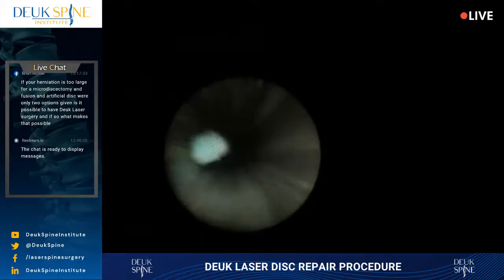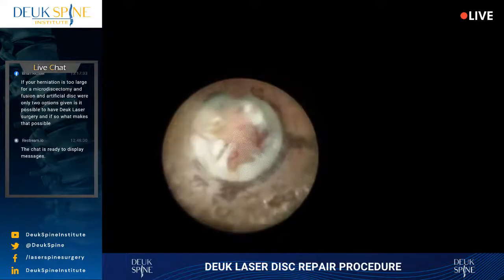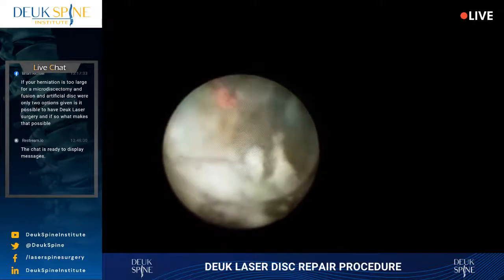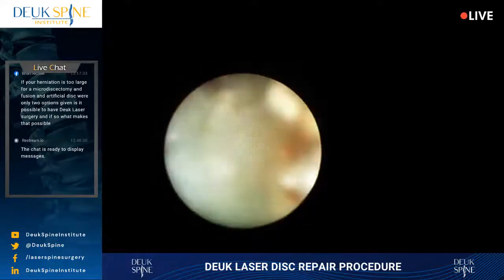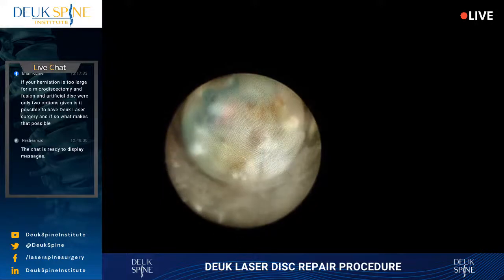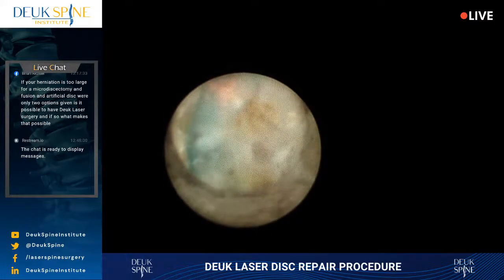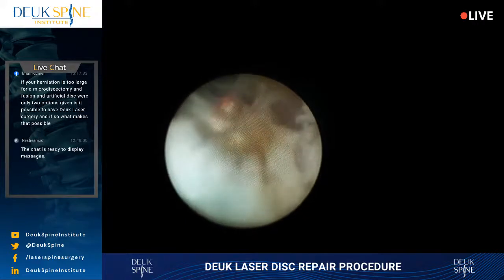You see the tear down there at the bottom? I'll show it to you again in a minute, but that's the tear in what's called the posterior longitudinal ligament. And that's the part that's kind of bleeding down there. That's the PLL. There's a herniation right there. And I'm going to sit here and basically remove herniated fragments from the back of the disc. Okay? And then I might actually go past the PLL because this patient definitely has herniated fragments in the epidural space. We call that an extrusion. She's definitely got extruded disc here. So I'm going to have to go down there and get up close and personal with my laser and my endoscope to the actual tear and try to remove pieces of herniation from down there in that little hole. Okay?